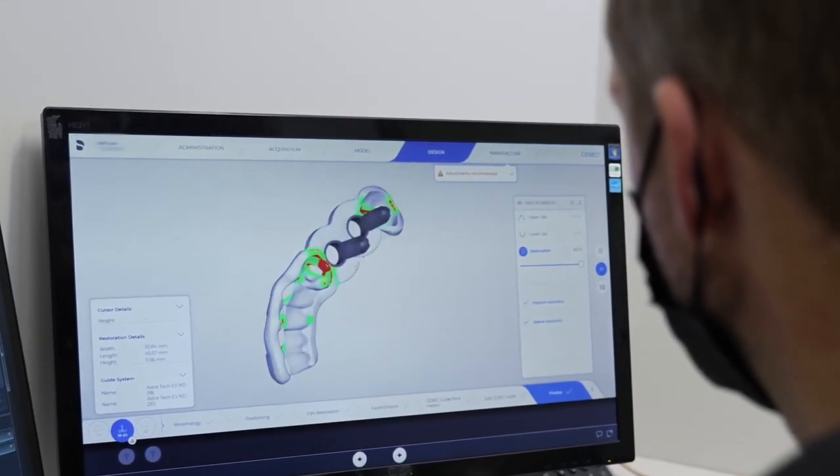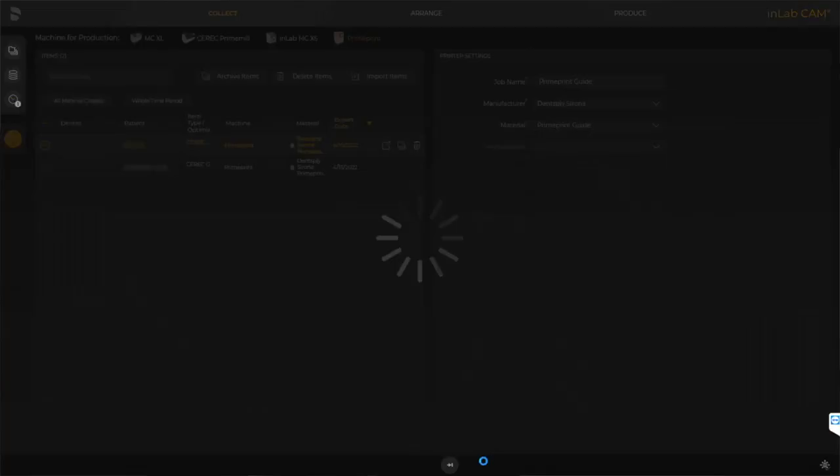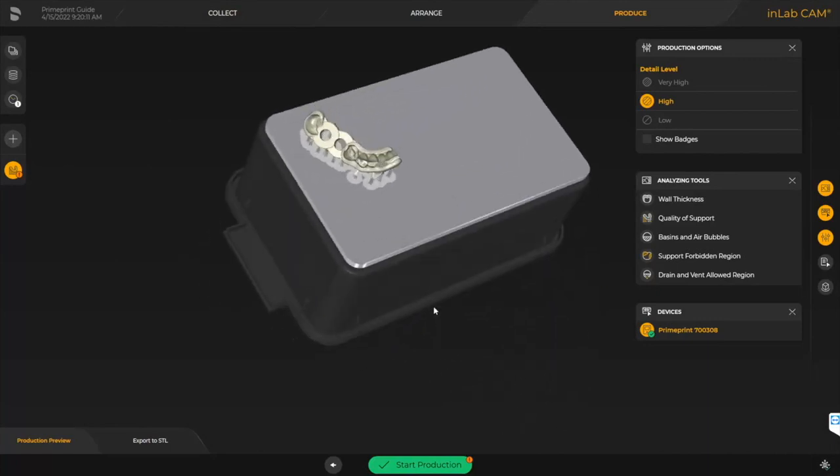We'll bring this into the manufacturing stage, and at this point we'll send this to the InLab CAM software. At that point, we just simply need to hit the fast forward button and it's going to bring us immediately to the manufacturing screen. It's going to have all the supports already in place and the guide correctly oriented for the best possible and highest quality printing job.